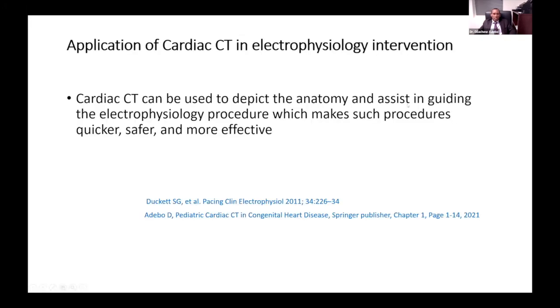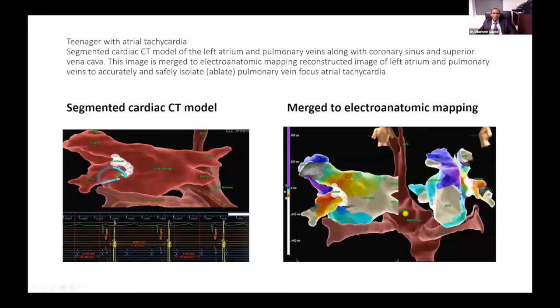Electrophysiology intervention also uses cardiac CT images. We have here a teenager with a pulmonary vein focus — left lower pulmonary vein focus — atrial tachycardia. We provided a segmented image of the CT merged to the electroanatomic mapping, with radiofrequency ablation focused to the ostium of the pulmonary vein to isolate that focus of atrial tachycardia. Again, faster, effective, and with less radiation dose.